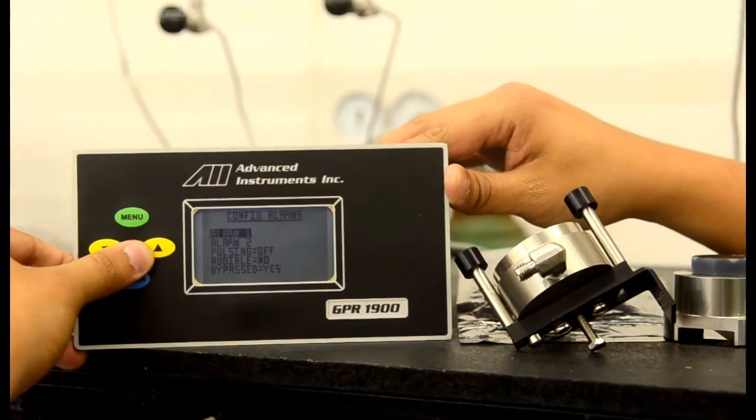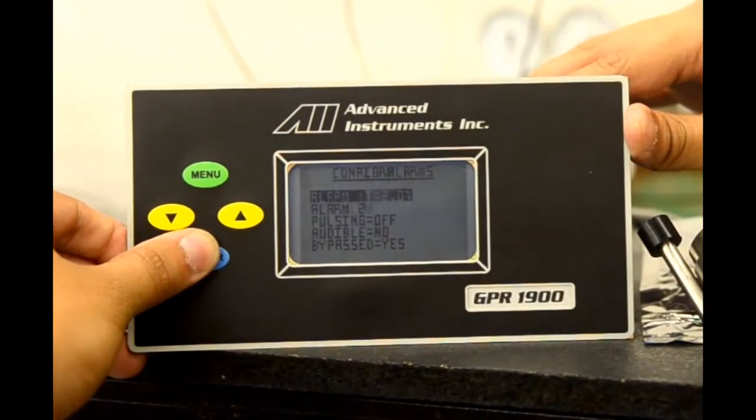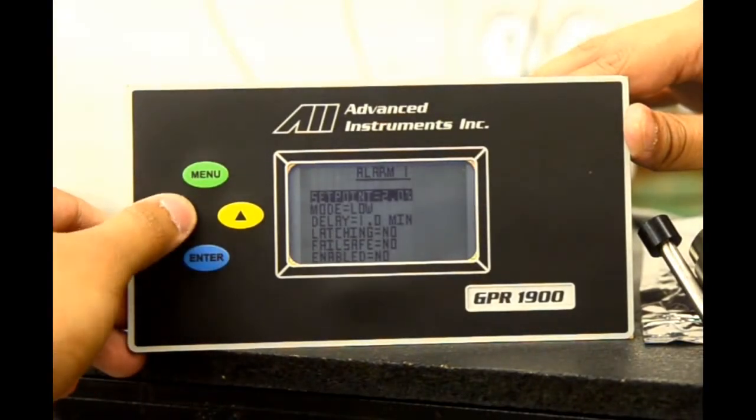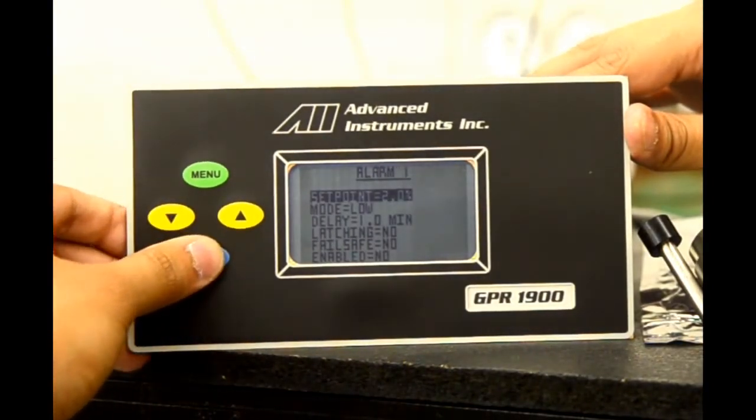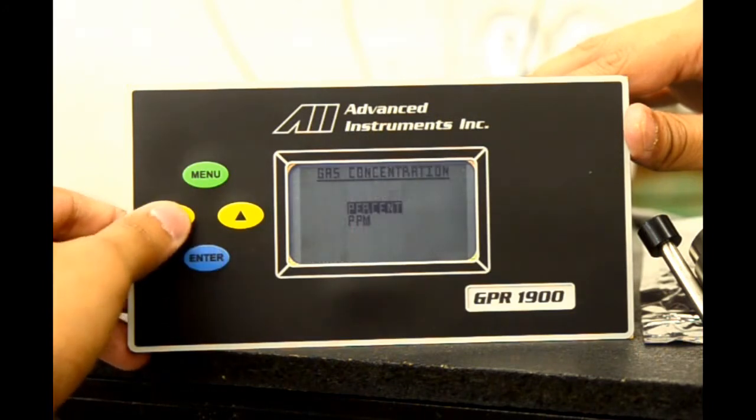We will now configure alarm one. We select enter on alarm one and are taken to the alarm one main menu. Here we see set point, mode, delay, latching, fail safe, and enabled.